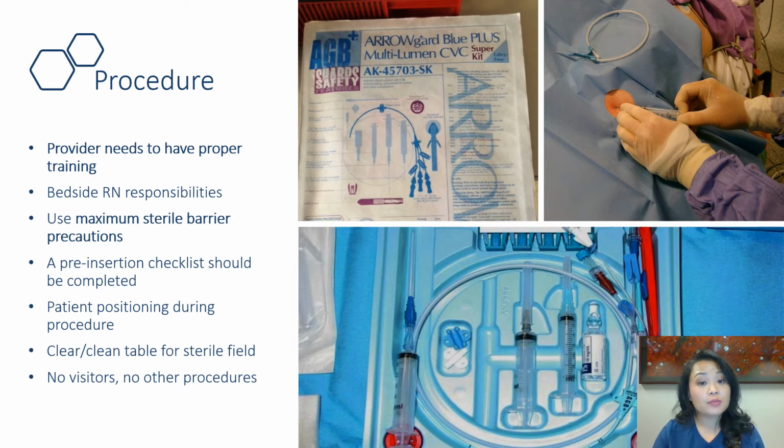Non-tunneled catheters are placed by a physician at the bedside. The provider needs to have proper training and supervision. The bedside nurse monitors the patient and observes the procedure. So as the bedside nurse, what exactly are you looking for? You will be looking for the patient's tolerance and the sterility of the procedure.